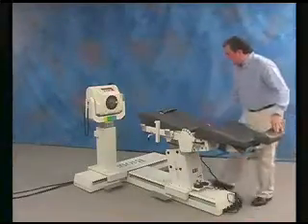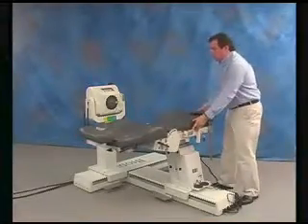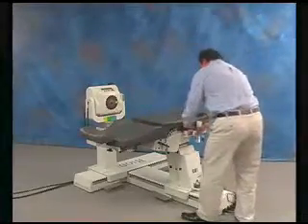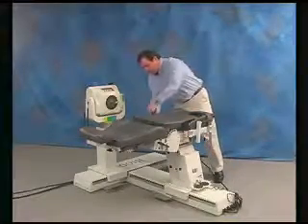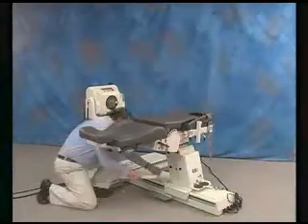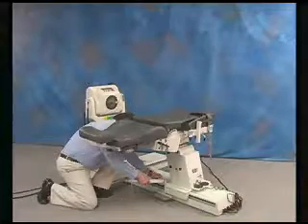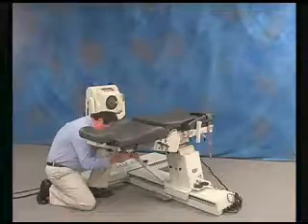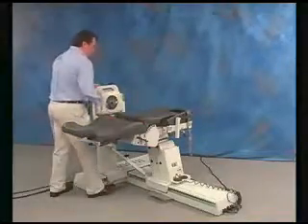Recline seat back to the zero degree position and rotate the chair to the zero degree position. Insert spacer pad. Insert seat stabilization bar. Move seat and dynamometer into position.